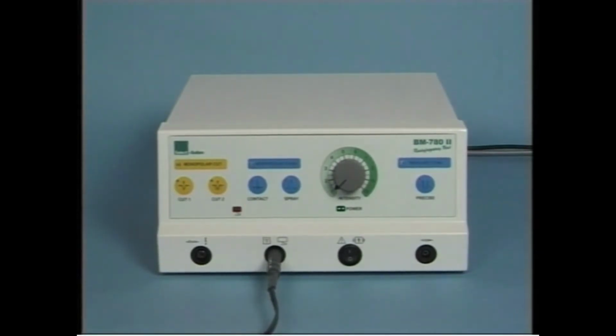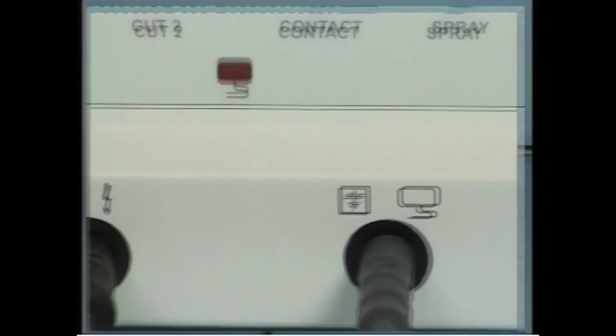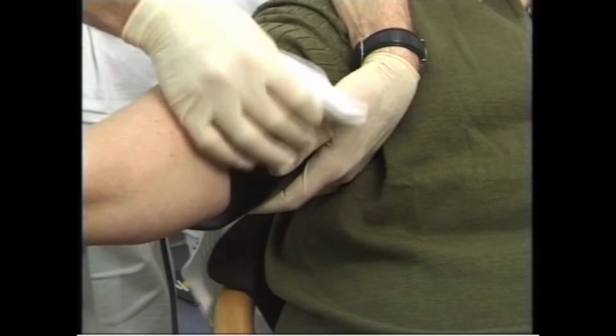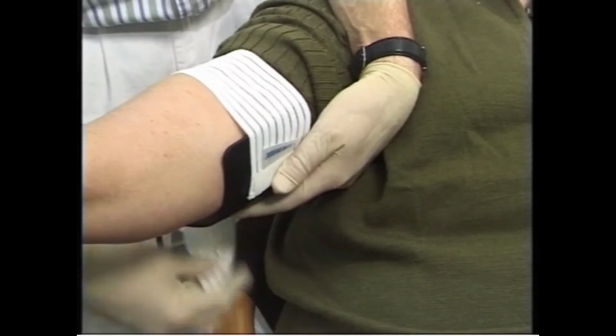If you use a split patient plate, the light will only go out when the split patient plate has been properly applied to the patient. In any case, you must always make sure that the patient plate is correctly and completely attached to the patient.